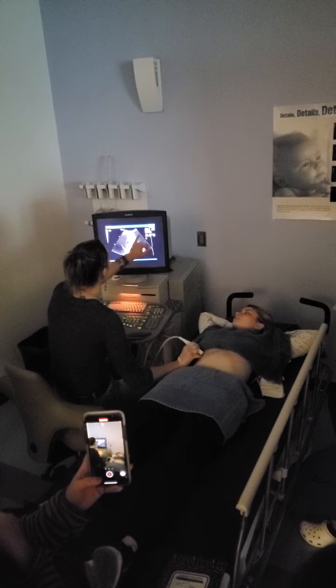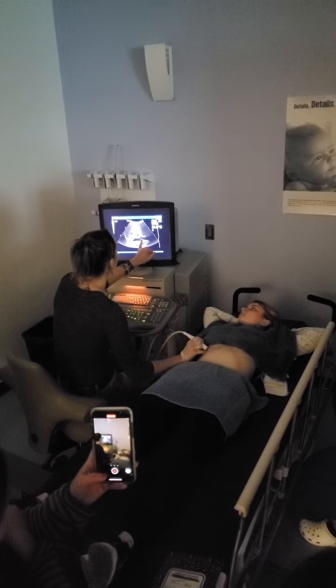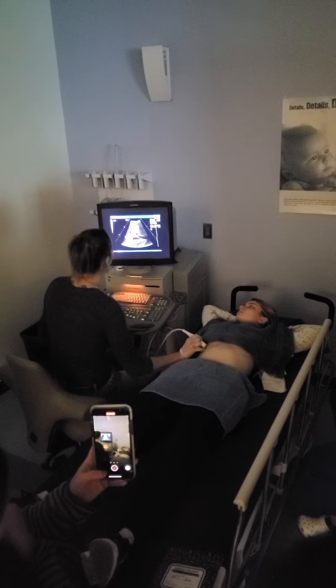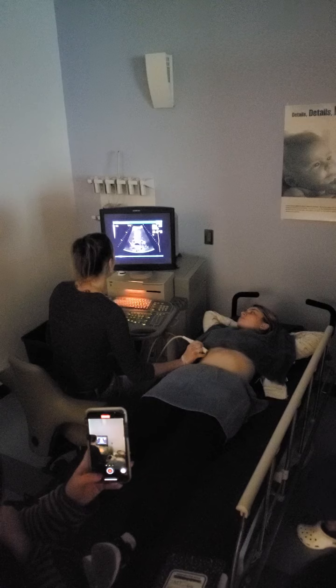So, do I care that we have no contact? No. I have a rounded structure touching a rounded structure. So I just want to make sure this guy's kind of centered, but it's okay if we have some artifact here. The other thing we could do, look, I don't even see any artifact. My image width is down. Isn't that amazing? She's amazing.